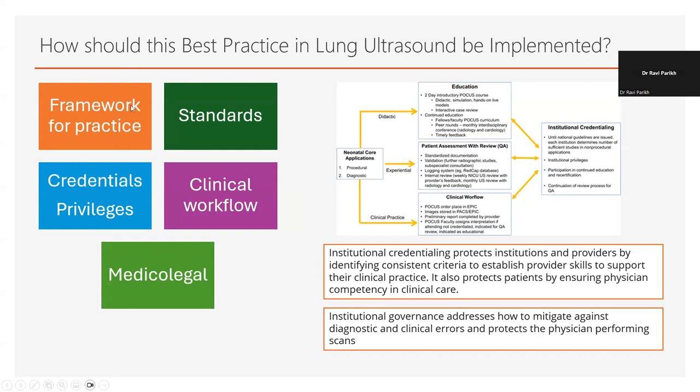But in addition to those guidelines, what we need is we need standards. We need standards for documentation and reporting, standards for really what and how we would do repeat scans, say if we decide we want to give another dose of surfactant, standards for how we're going to implement our practice with LISA, say, for example.